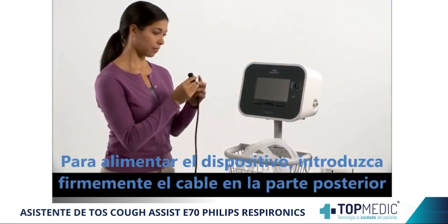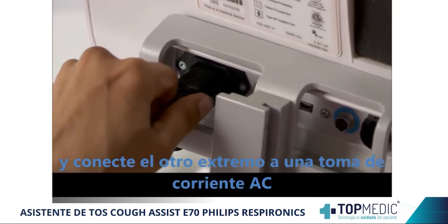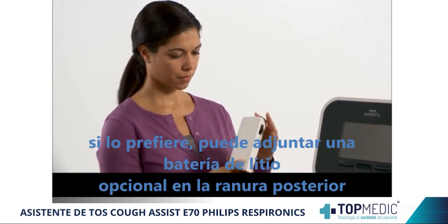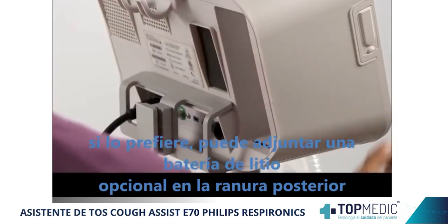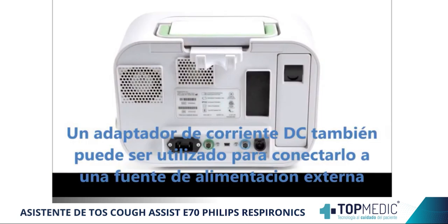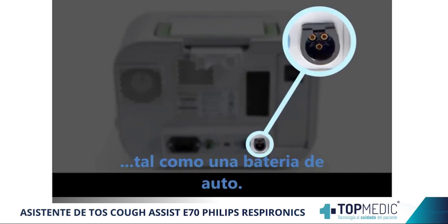To power the device, press the power cord firmly into the back of the device and plug the other end into an AC outlet. If you prefer, you can attach the optional lithium-ion battery into the detachable battery slot on the back of the device. A DC power adapter can also be used to connect to an external power source, such as a car battery.